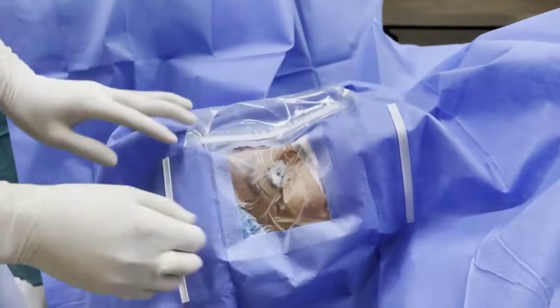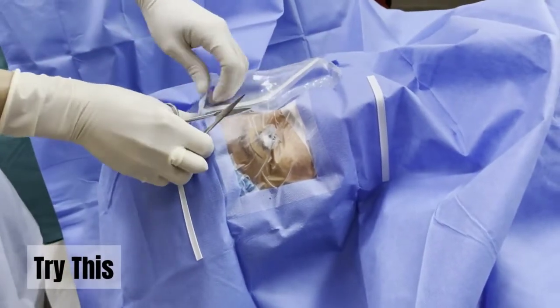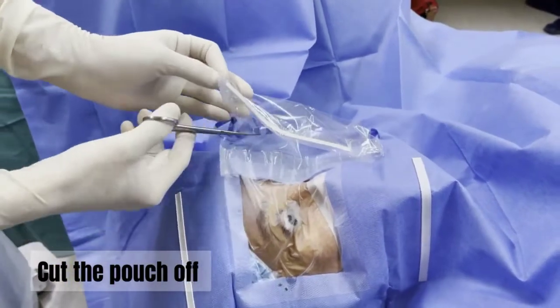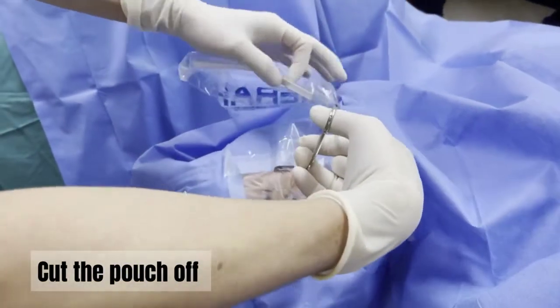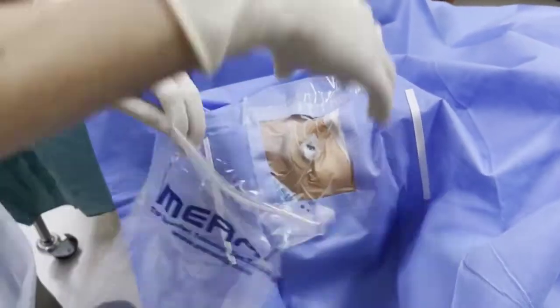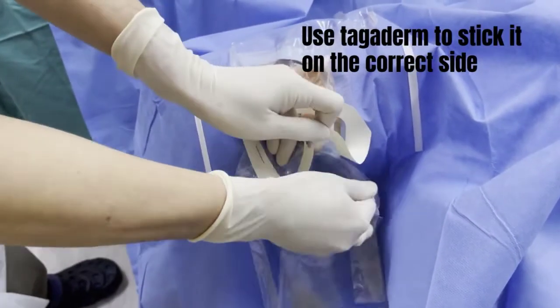The outer diameter is about 5 millimeters. Oh no, did I just drape the wrong side? Do I need a new drape? Fear not, there's a way to solve this. First, cut the pouch off using the dressing scissors. Then use the Tegaderm to stick it on the correct side.